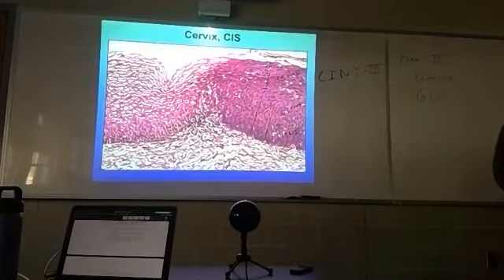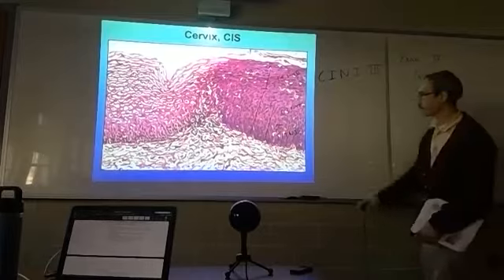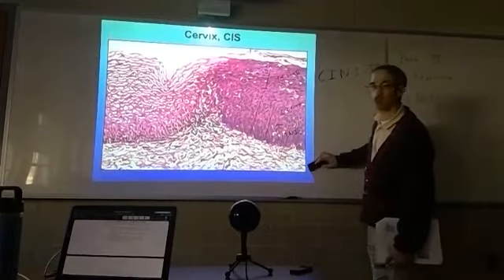Also, the cytomorphology of the specific cells will influence what grade the pathologist assigns. There's variability in how pathologists will grade the dysplasia. Someone will say, oh, this is CIN2. Others will say that same thing is CIN3. There's no very specific quantitative way of defining it, but this is generally how.